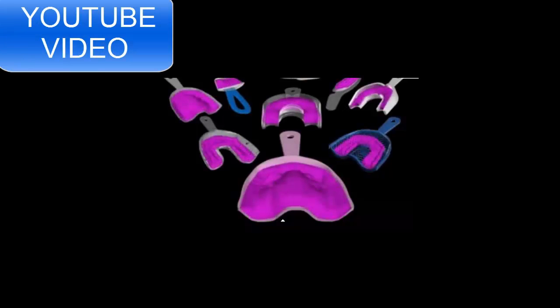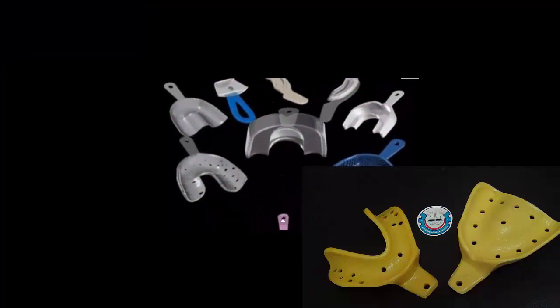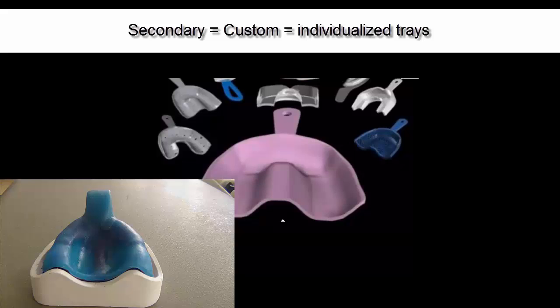Trays are used to carry impression materials when dental impressions are taken. We distinguish between two types, prefabricated and individualized. In the image above, you see several different types of prefabricated impression trays. At the bottom of the image, we have individualized impression trays.